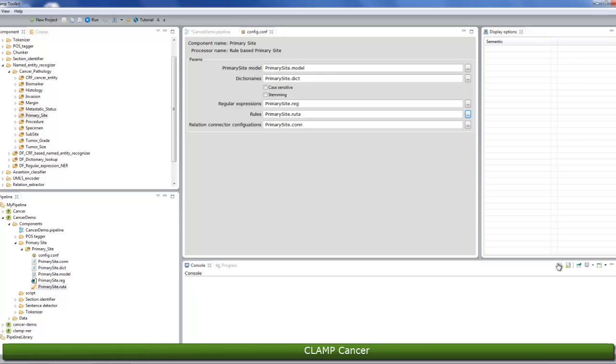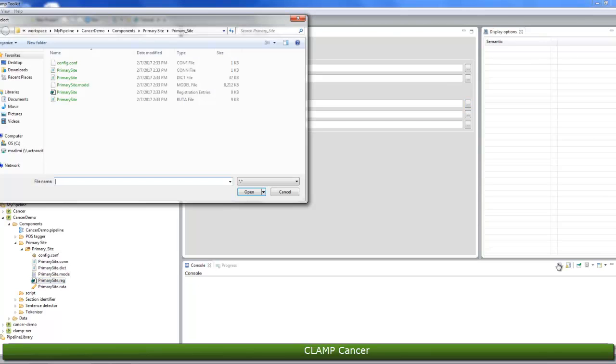Similar to the primary site dictionary, you can either edit or replace the regular expressions file. You can edit it by double-clicking on the file in the pipeline panel, or you can replace it by clicking the three dots button next to the field.